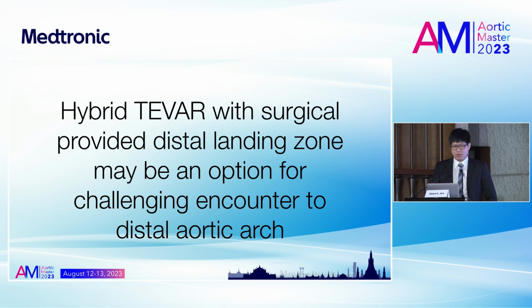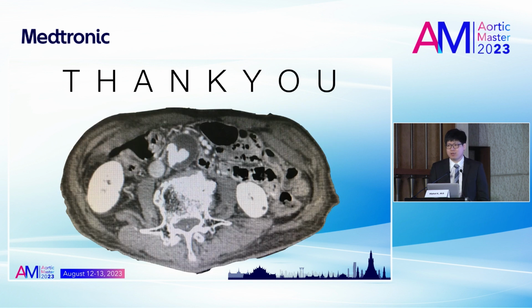In conclusion, the hybrid TEVAR with a surgically provided distal landing zone may be a good option for any challenging encounter at the distal aortic arch. Thank you.